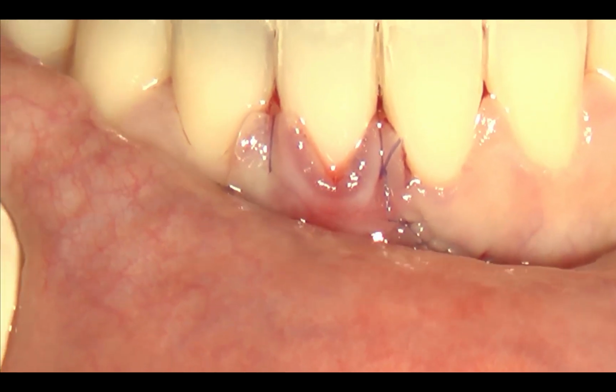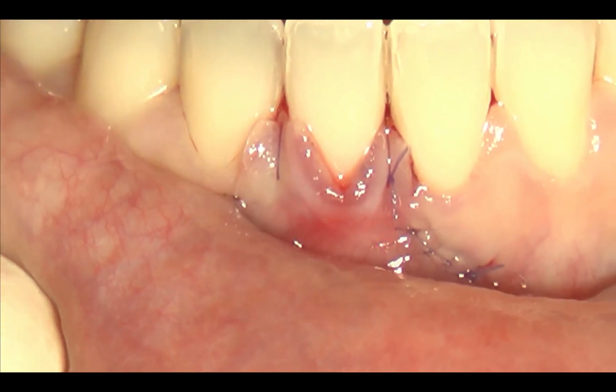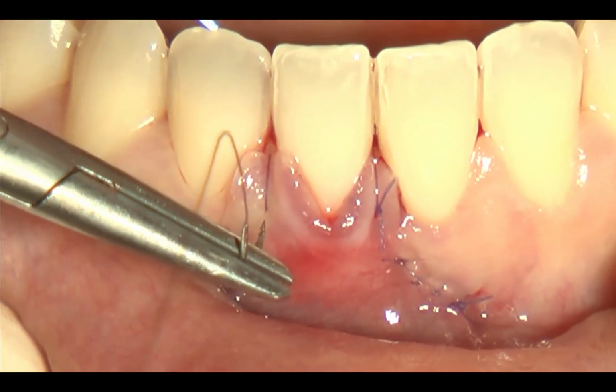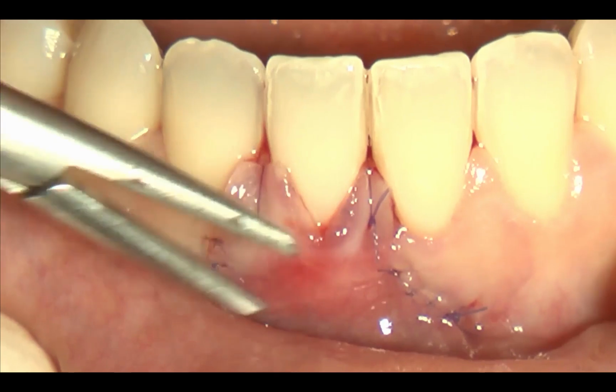Here and here. In order to place only one knot in each papilla, I change the position of the knot. The first knot was positioned at this papilla. Now I take this papilla and I make the same suturing, surgical anatomic papilla.